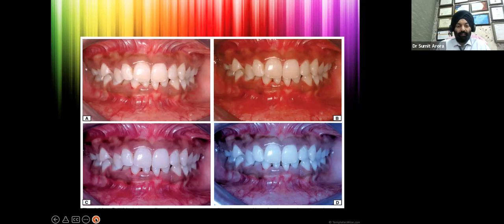The A is showing that gingiva is perfect. In B, the white balance is set to cloudy. It is showing that there is inflamed gingiva. Patient needs urgent help, so that the inflammation, we need to subside that. In the C image, it is changed to fluorescent. No use. Again, D is changed to another mode. It's of no use. So we need to check white balance along with the flash, and then only we are going to get proper shade.